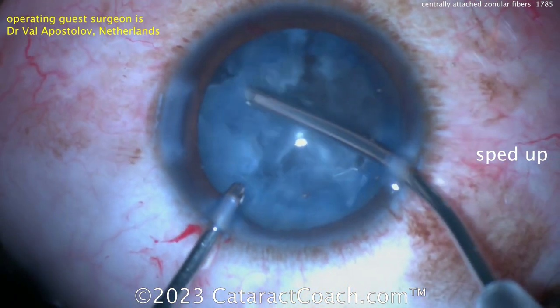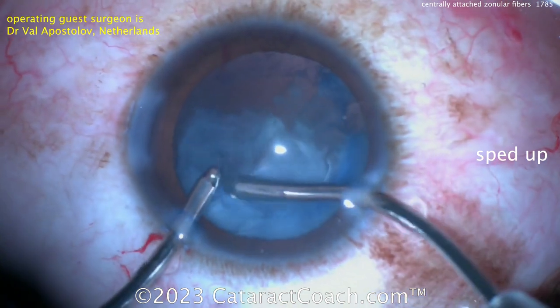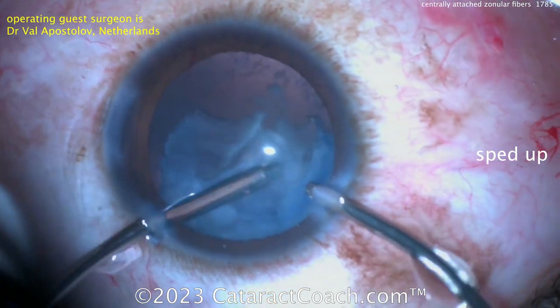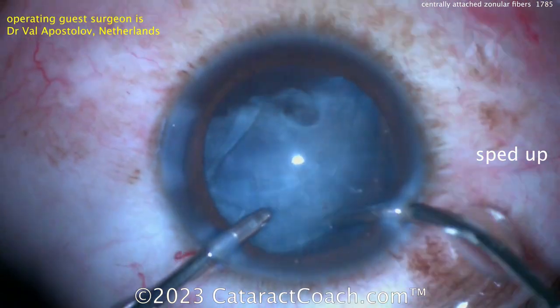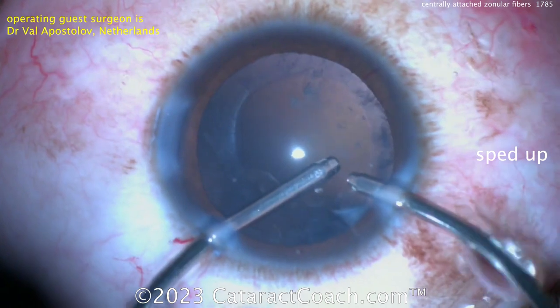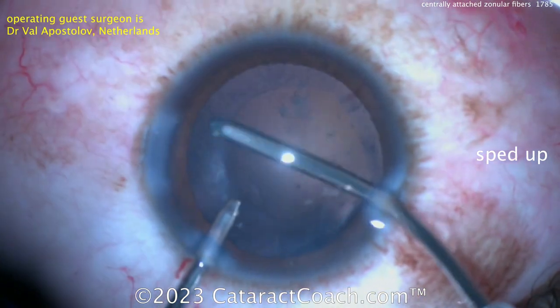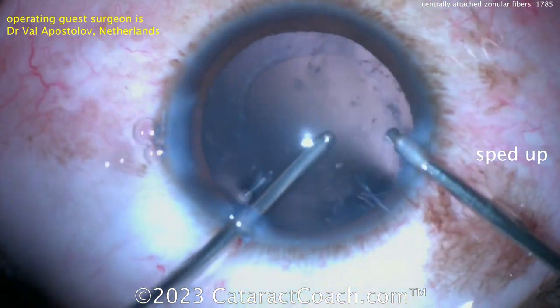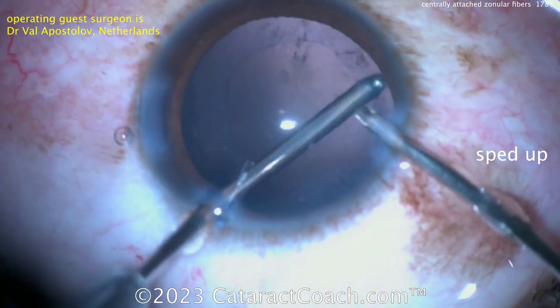And so here you go, bimanual IA — even easier approach. In a case like this, you don't even need the phaco probe because you don't need ultrasonic energy, you can just use the IA. If any pieces get stuck, just rub the two instruments together to push them down the port of the aspirator. Going in the capsular bag, using the infusion to separate out that lens material — that's beautiful. A lot of great tricks you can learn from other expert surgeons here. Let's see how you can clean up that capsular bag. Sometimes in a white cataract, some of these changes are fibrotic — you can't get all of them off, but cleaning up pretty nicely here.